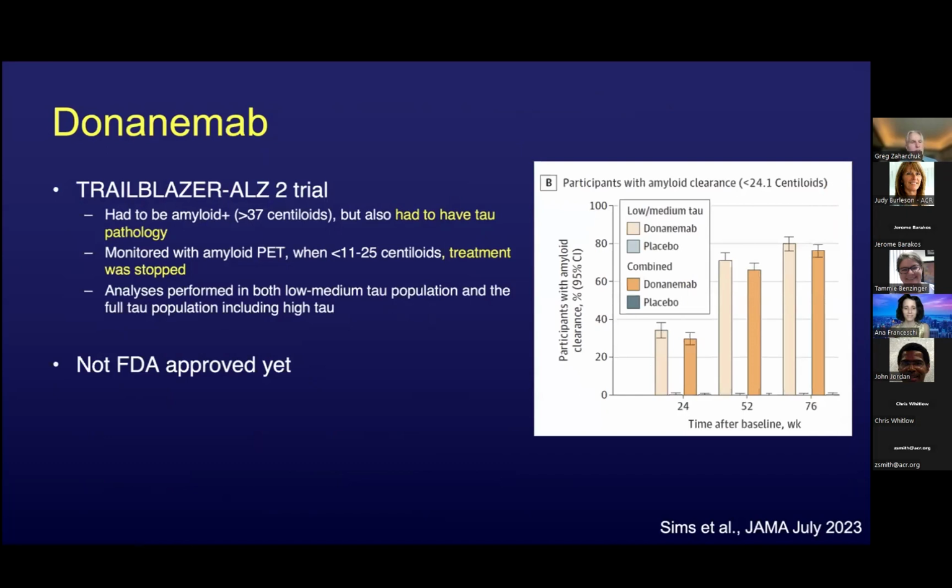So this has still not yet been FDA approved, but I think this is coming, and I think it's good to be aware of it and to start thinking about maybe in your centers, do you need capacity to do tau imaging of some kind?